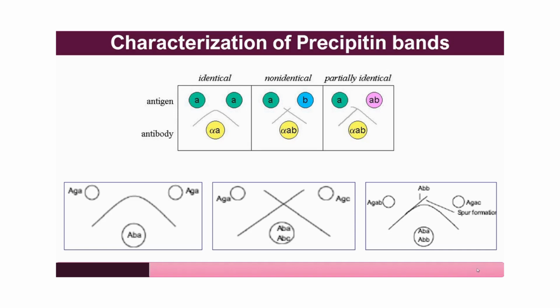And if the concentration of B was more than the concentration of A, it would have pushed the precipitin band towards the antibody side, appearing near the antibody well and crossing like this. The precipitin band of antigen A would have appeared smooth like this. Or if the concentration of B was less, it would have appeared very close to the antigen.